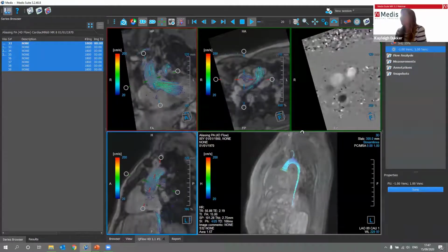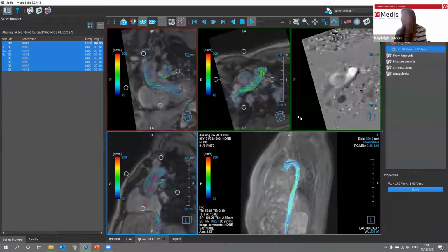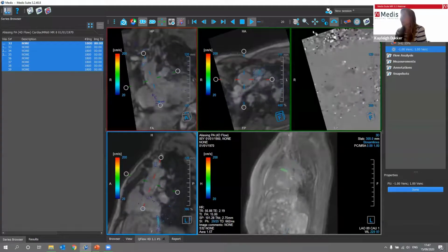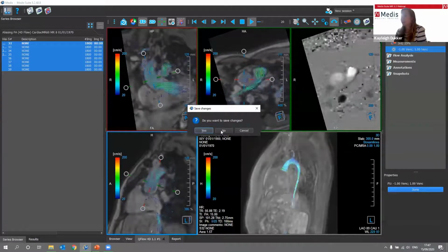So thanks for these nice questions. What is left are the things for the platform. It's a bit more technical, but I do want to show you where it's located.